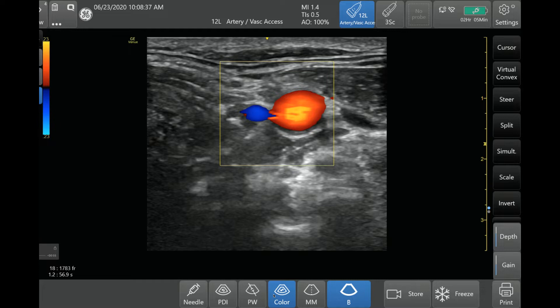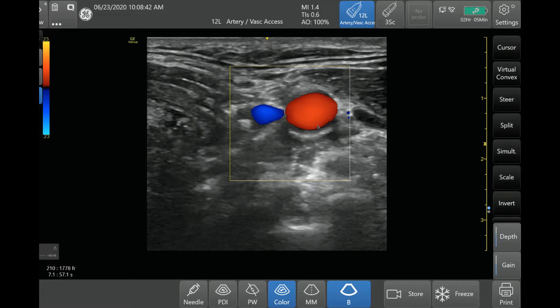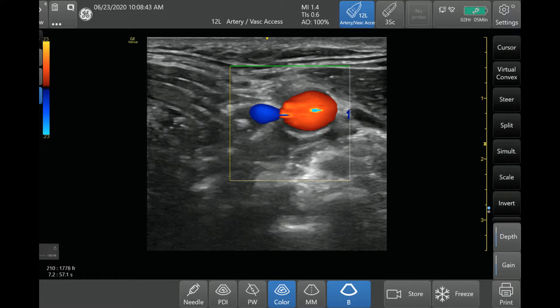Every system will have a color Doppler button — where it is will vary by system, but each system should allow you to activate it. Once you push that, you'll see a box that comes out. This is your color Doppler box, and you can adjust that box to where you want the color Doppler to image. The only thing that will show up with color Doppler is whatever is inside the box — outside, even if there are vessels, you're not going to see any color Doppler. So make sure you put the box right over your structures of interest.